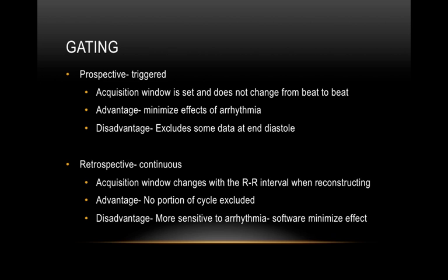However, the disadvantage is because we are shortening this acquisition window, we are not capturing the entire cardiac cycle. For the most part, this doesn't cause any significant issues as we generally still have in diastole and in systole, but there could be some issues because we would be losing part of the diastolic phase.